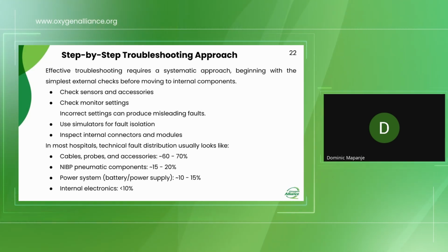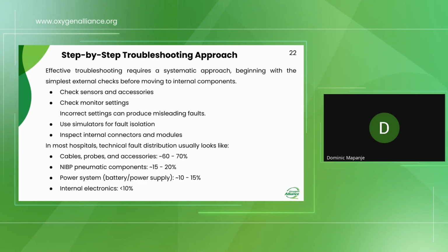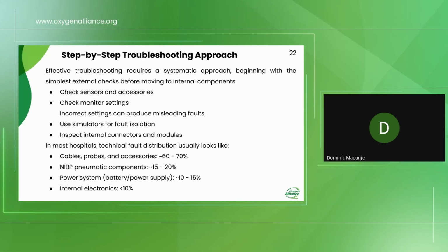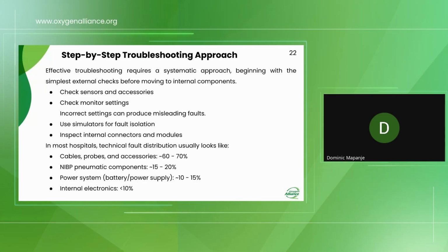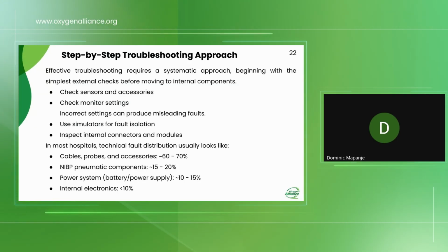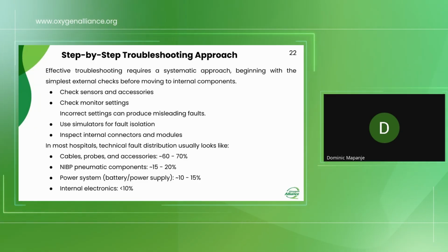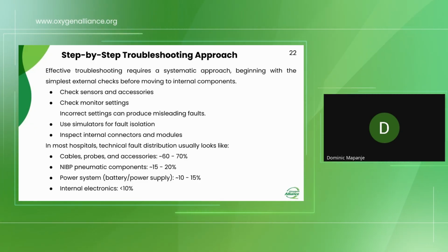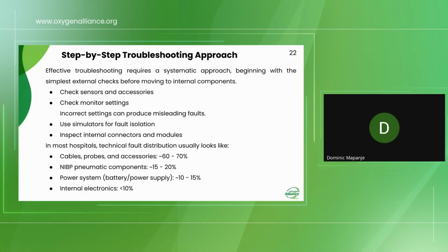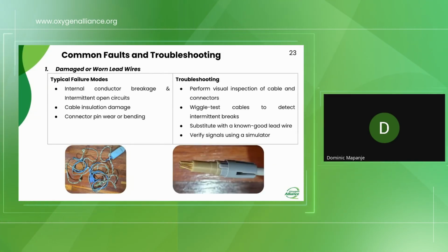So it's advisable that you start with the most commonly found faults, which are the external accessories and probes, before you go into the less than 10% of the faults that actually do happen. So that is disassembly. So start with the easy part of the troubleshooting, then you go in there. And then these are some of the common faults that actually do happen.